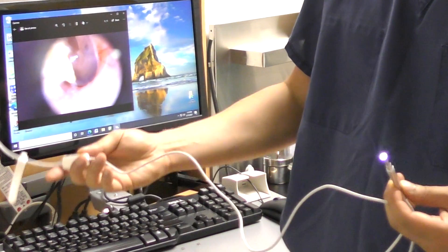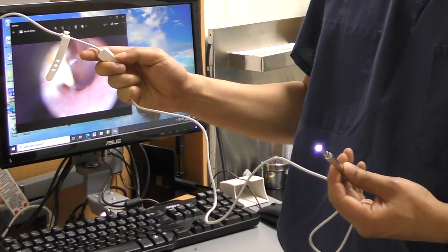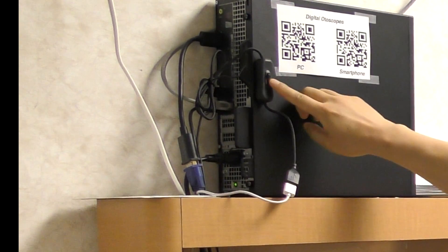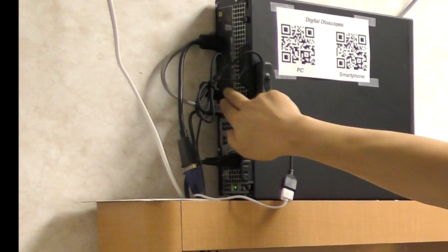The digital otoscope device is attached to a standard USB cable. The cable itself contains a dial to adjust brightness. The cable is connected to a USB power on/off switch that can be purchased separately before being plugged into any standard computer USB port.